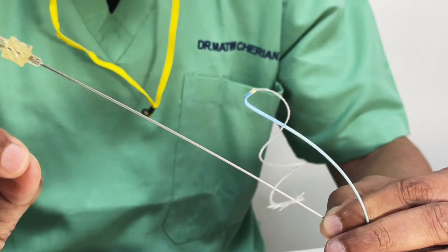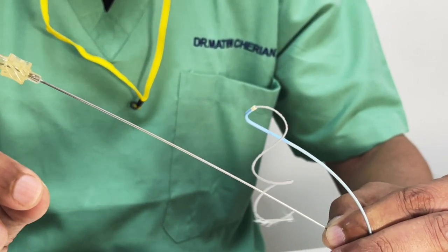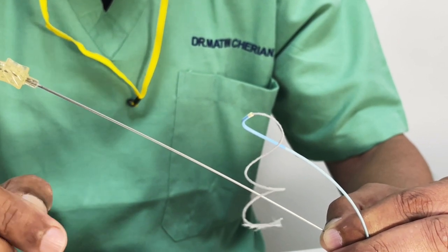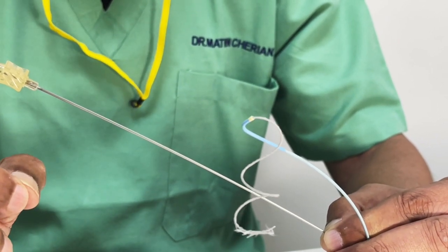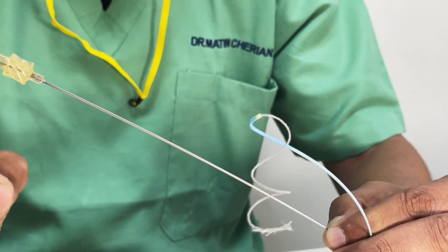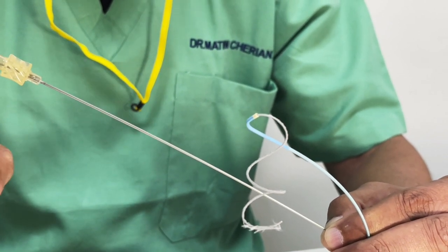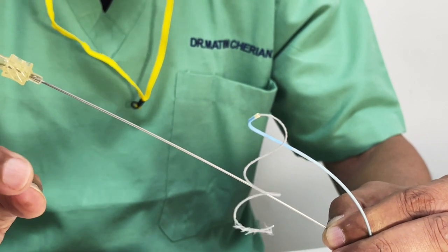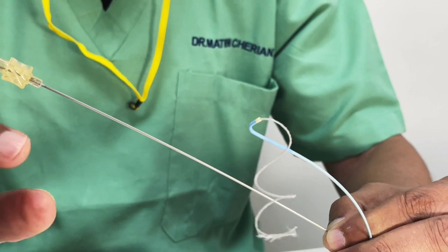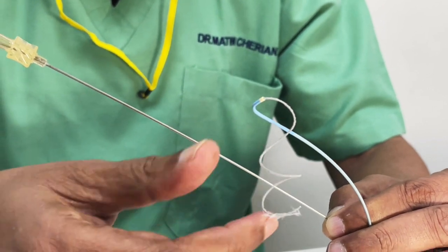So when you push this coil, if you find that the coil is going straight forward, don't panic. Pull the catheter back a bit and try to weave it by pushing the catheter forward and backward rather than actually trying to push it further. Once a few loops are formed, it will sit over there. But most of the times, if you have sized it correctly, it will form a loop. Okay, so this is how.